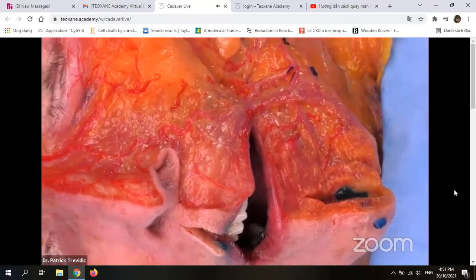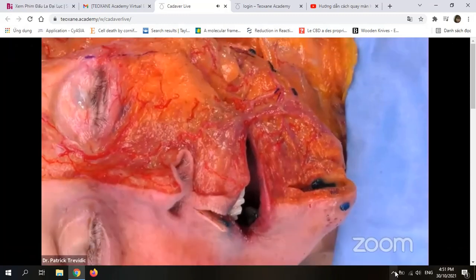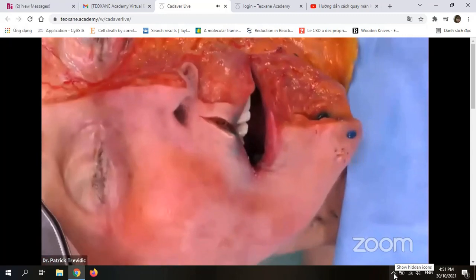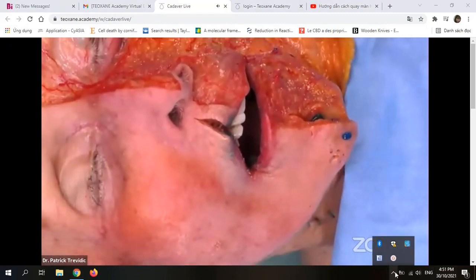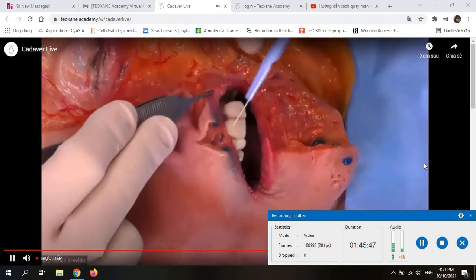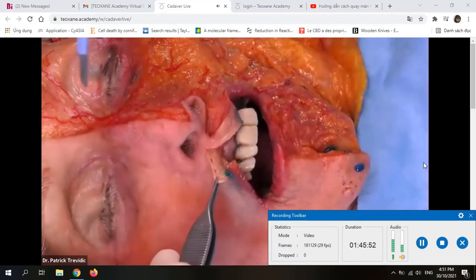Thank you. Patrick, we have got questions about French kiss technique, and we have got a time. Can you show us where we should inject the bolus and show this bolus if you can? Yes, I will show you. So we are going back face, and we are going to the area where I injected.